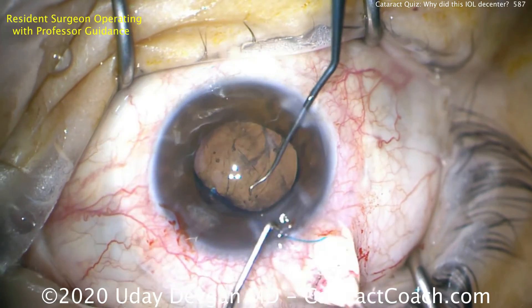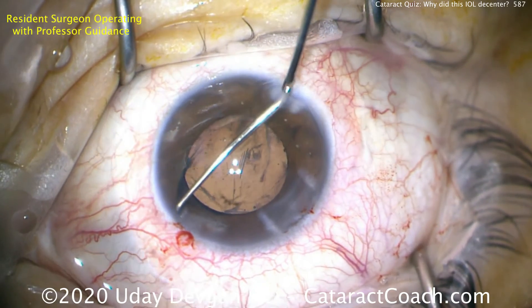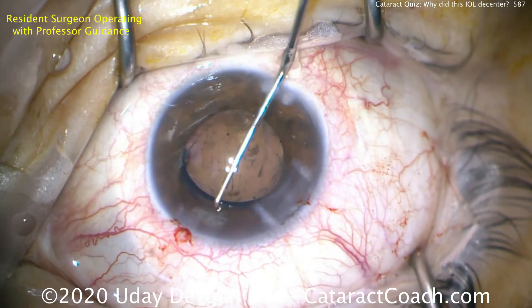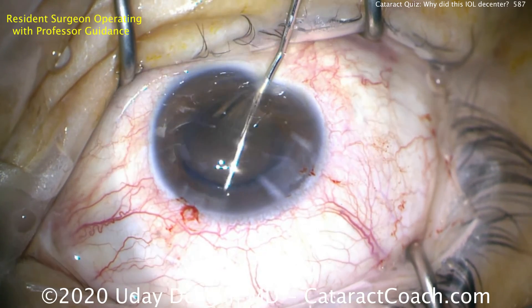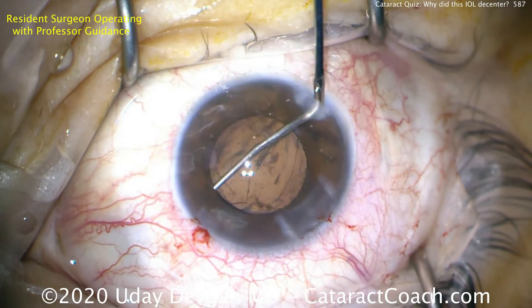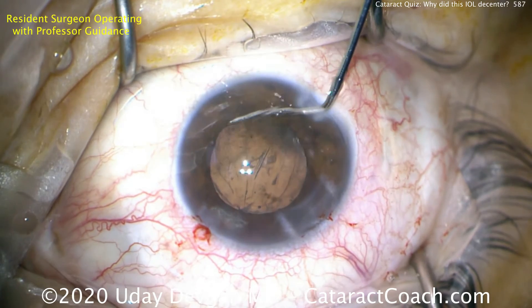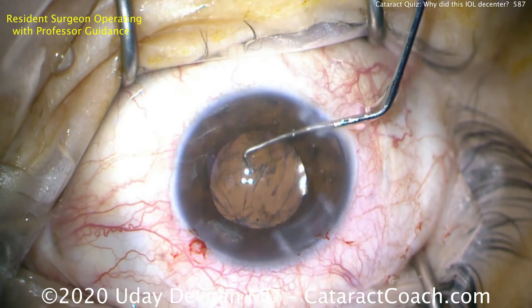In this case, the decision to leave a broken lens in the eye necessitated a trip back to the operating room. We'll get that haptic dialed in there. So if you're in this situation, never leave a broken lens inside the eye. It's much easier just at the same sitting to explant it and get a new one — always the best option.